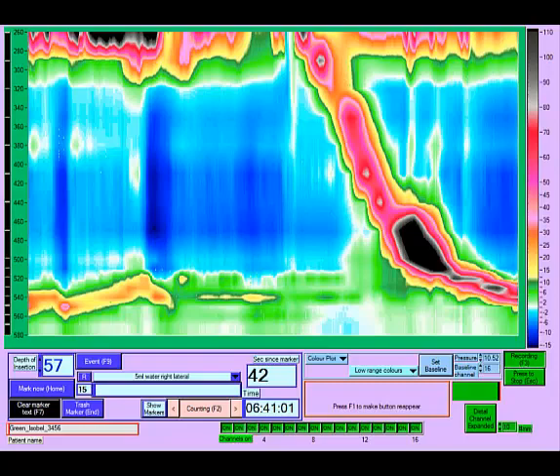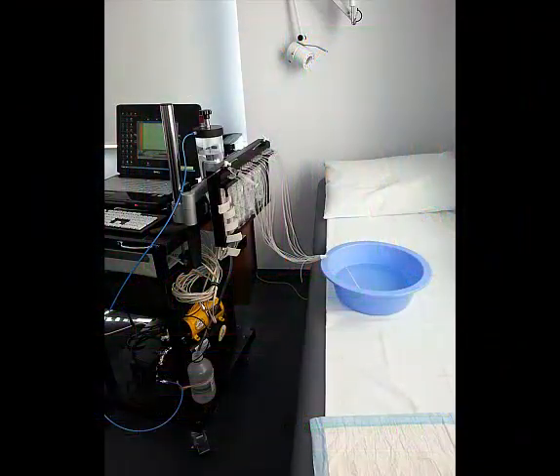At the conclusion of the study, remove the catheter from the patient and place it back into the bowl of water for another period of underwater recording. This is to check for and allow later removal of any pressure drift that may have occurred.